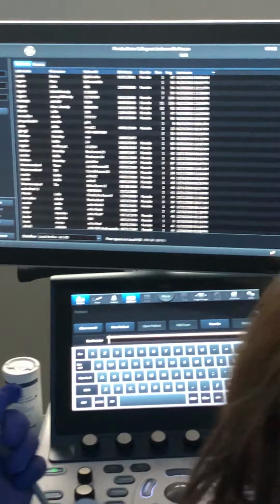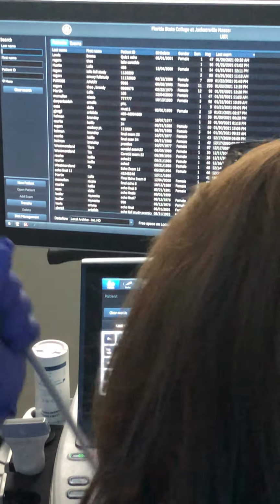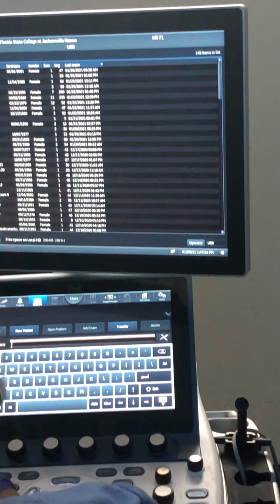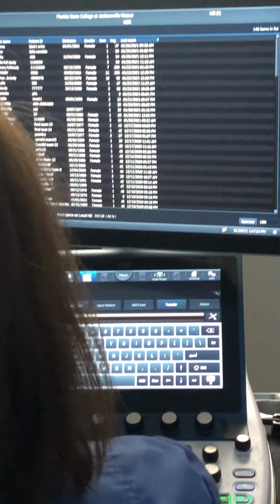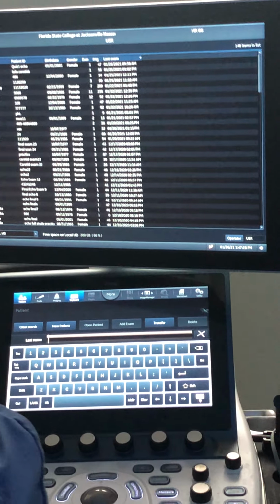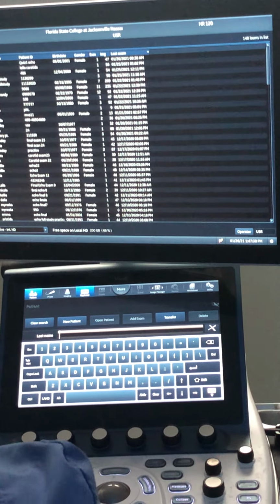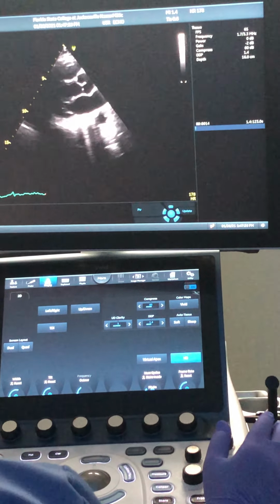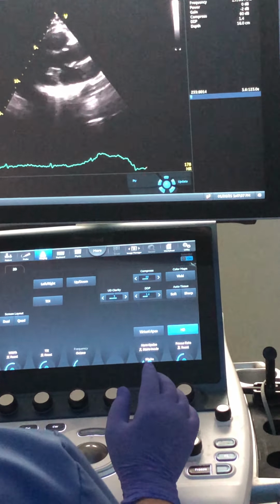Aortic calculations. So let's start with aortic stenosis first. What are the calculations that we do for aortic stenosis? Valve area, so aortic valve area, peak velocity and mean velocity. Okay, so max pressure gradient, sorry, and mean pressure gradient, which is going to give us our peak velocity and our mean velocity.